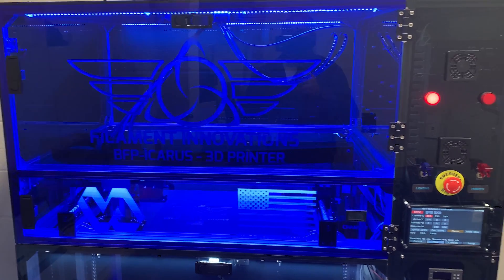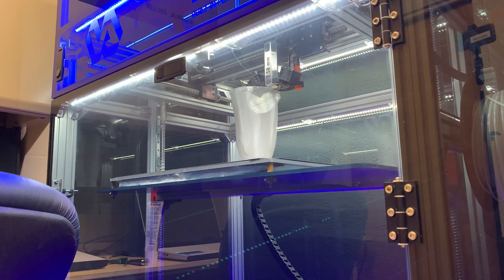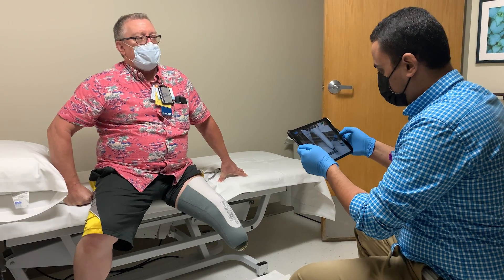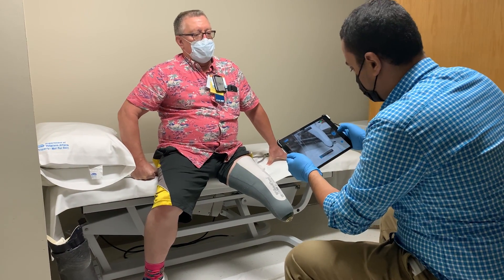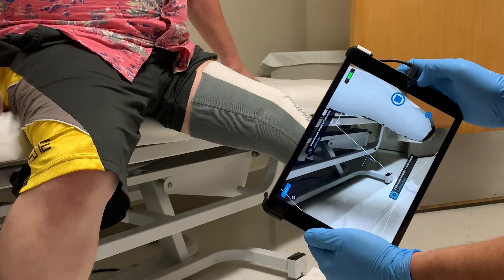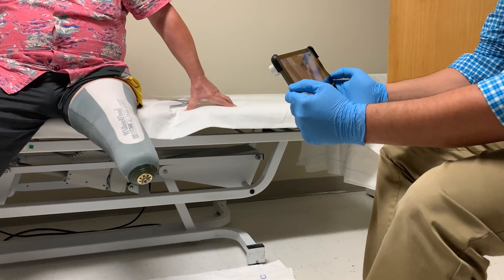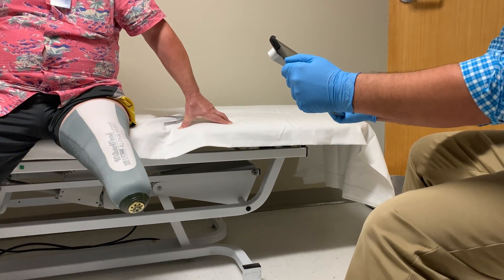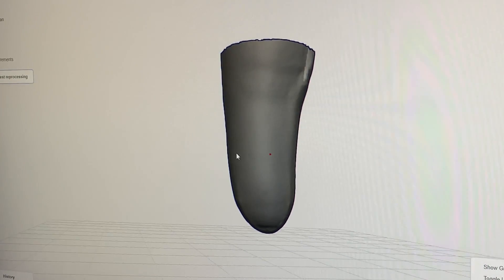The process starts from taking a scan of the veteran's limbs to capture the shape of their limbs or their stump. We take this scan of the veteran's limb by using an iPad with a structure camera to capture the whole limb, and then we convert it to our CAD software.